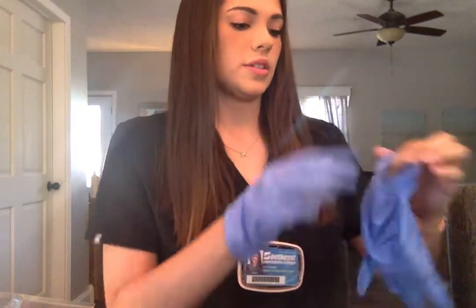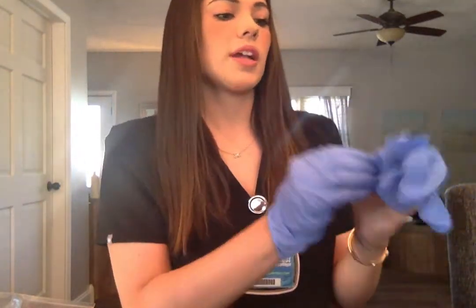I'm gonna perform an Allen's test just to make sure that this patient has enough circulation — that if I do any damage to the artery, their hand will get enough blood to it anyways.